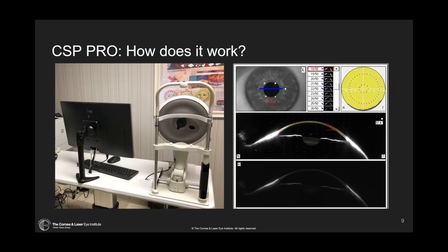How does CSP Pro really work? You have your rotating Scheimpflug camera that rotates a slit around the eye while the camera captures images the entire time, giving cross sections of the cornea and sclera. CSP Pro works by doing two rotations or revolutions: the first with bright illumination to capture everything about the cornea, and the second with lower intensity to reduce flare off the scleral tissue, resulting in really good mapping overall.